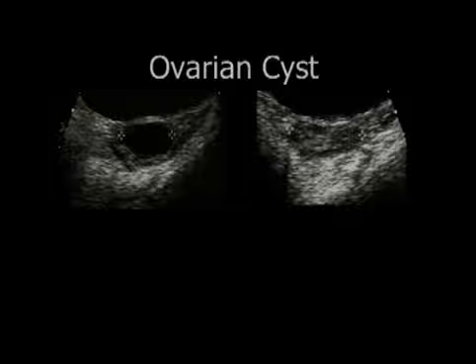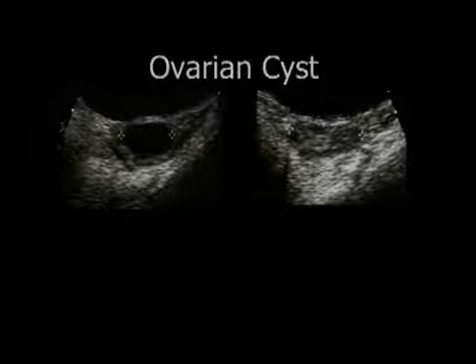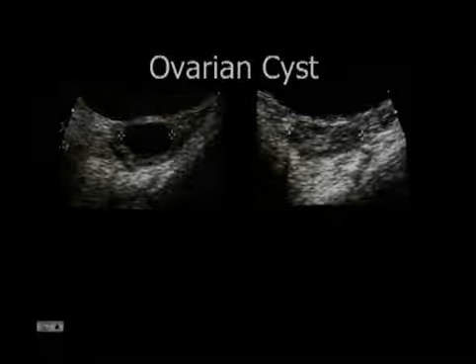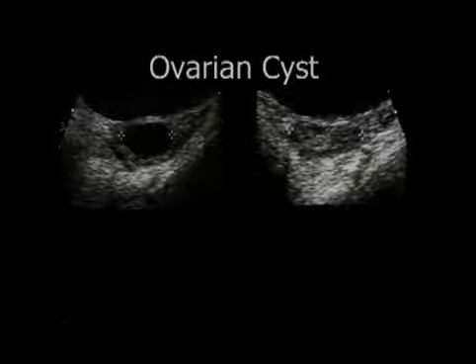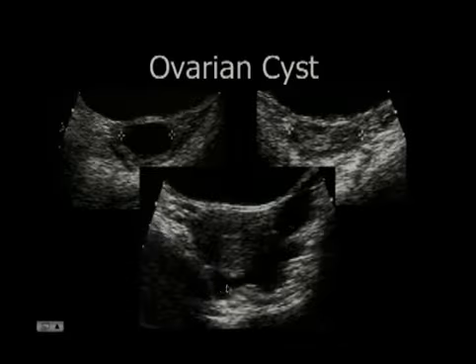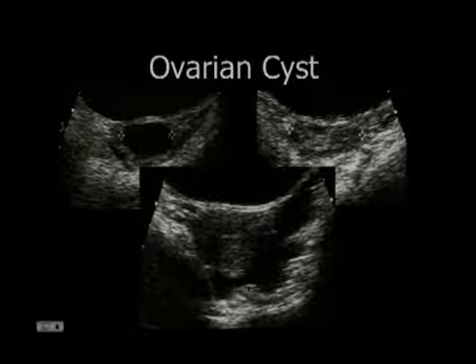My favorite case here is this child who was in our department. We were doing an ultrasound. She was having pain that was in fact localized to the side with the dominant follicle. As the sonographer came out to show the images to us, there was a cry of pain from the room. We went back in and rescanned, and now there was all of this free fluid within the cul-de-sac, which was not there before, and this child ruptured her cyst right in the middle of our exam room.